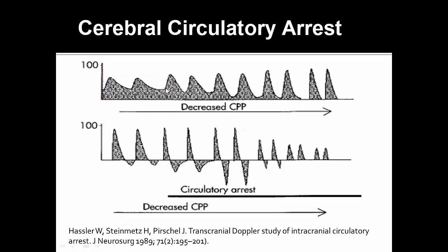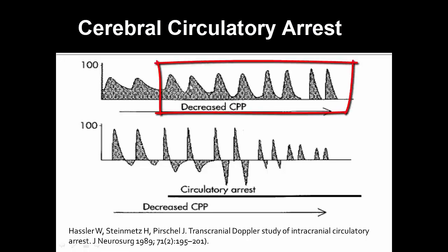As time goes along, as the vessels in the brain have external pressure coming from ICP, you'll notice that the systolic phase rises a bit. And you'll notice that during diastole, because it's a relaxation phase, ICP can sometimes become more than the diastolic pressure, and you eventually get what is known as diastolic blunting.